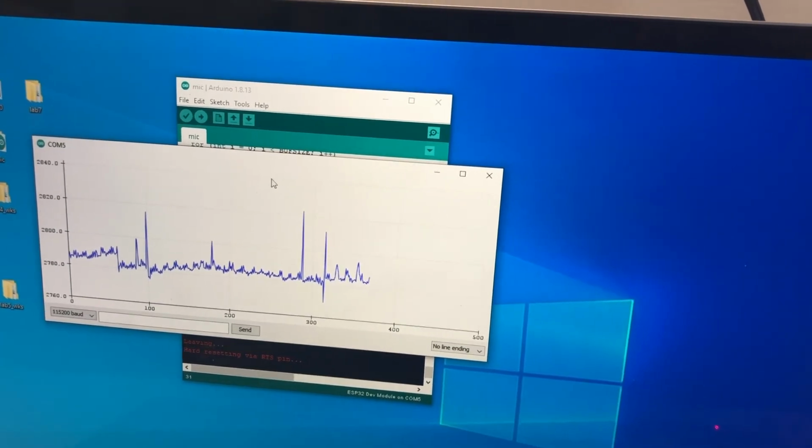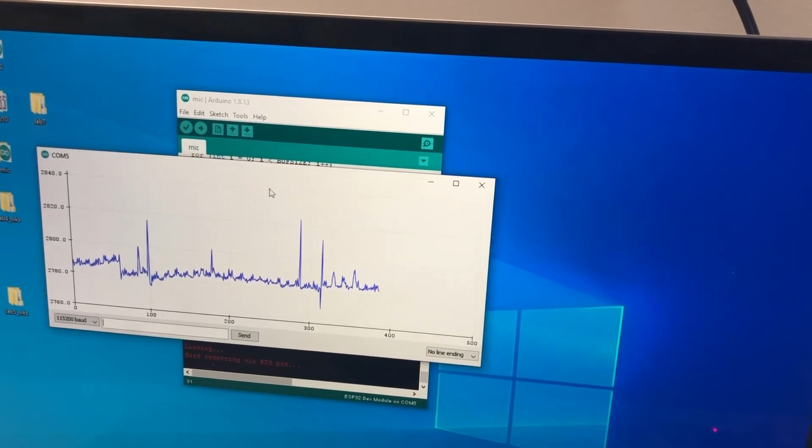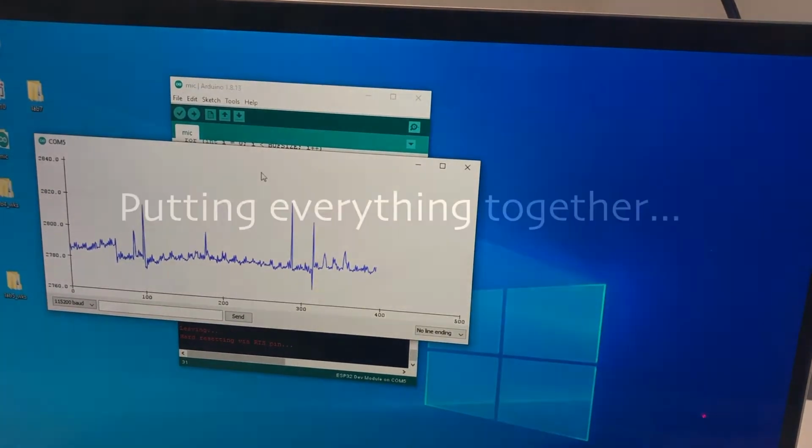So yeah, each time you heard the snore, you saw that spike go up, so we can monitor snoring with this microphone. And so yeah, that was our third sensor.